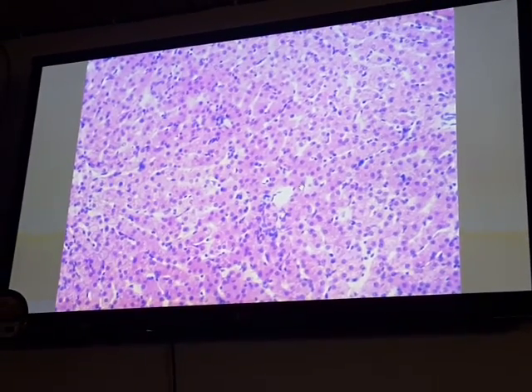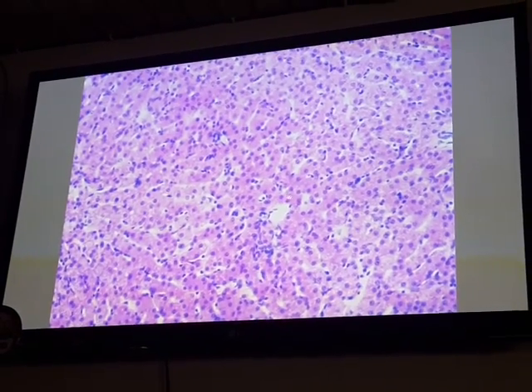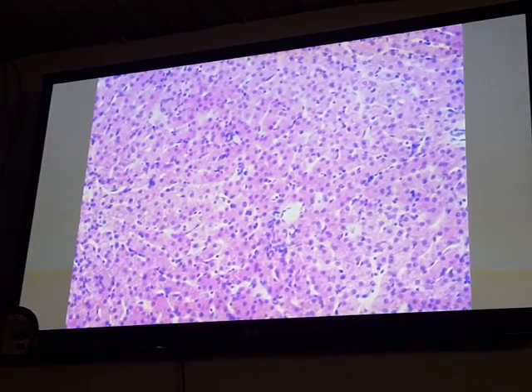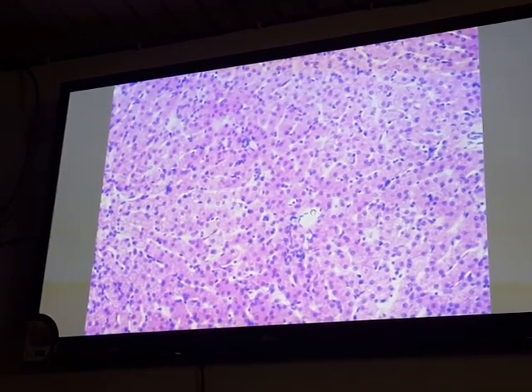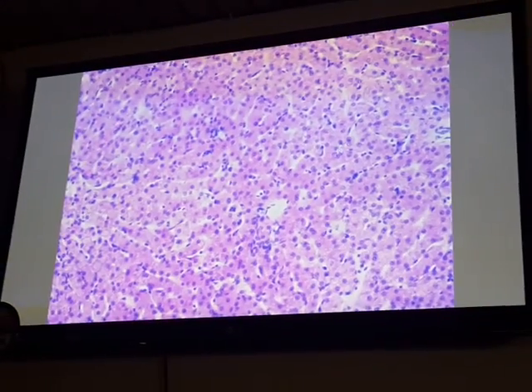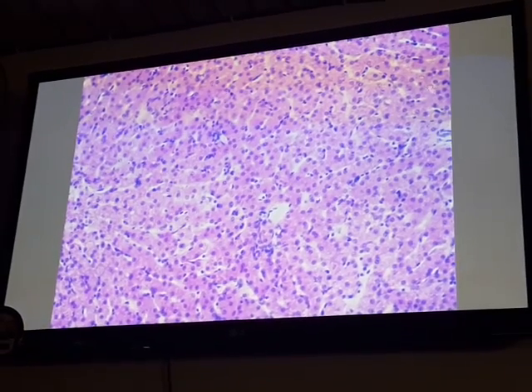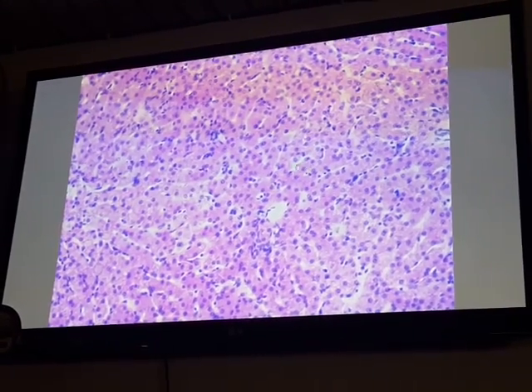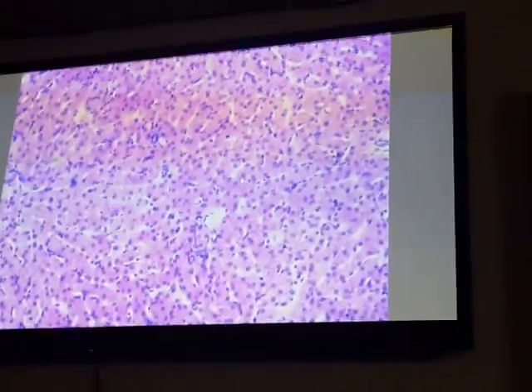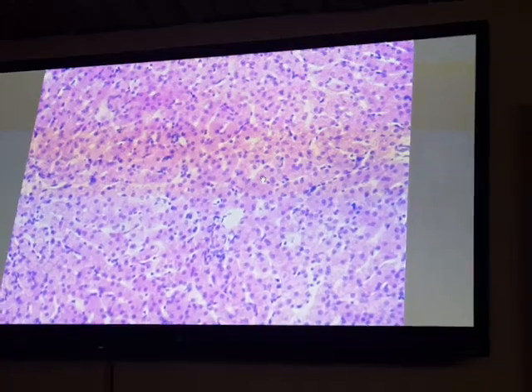The lobule consists of a center and a periphery. In this center we have a central vein or central lobular vein. The hepatocytes are arranged in interconnected plates disposed radially from the center of the lobule to the periphery. What is the shape of the hepatocyte? Polyhedral with central spherical nuclei and acidophilic cytoplasm. Hepatocytes constitute 2/3 the mass of the liver.